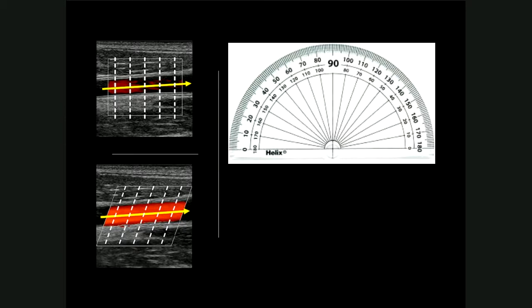So if you're looking at this, and it's kind of hard to see, it looks like this, and then the flow is like that. It almost looks like a 90-degree angle. There's a slight tilt. Let me redraw that. So if we're looking at the part of the vessel here, and our beam's coming in like this, and our vessel's like this, we have a very slight angle.